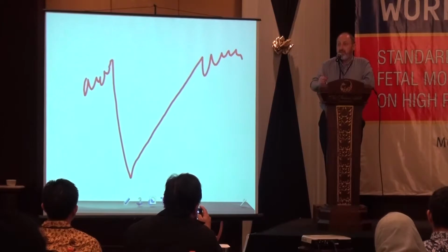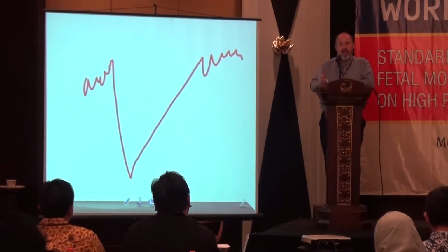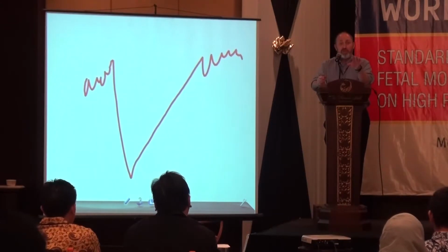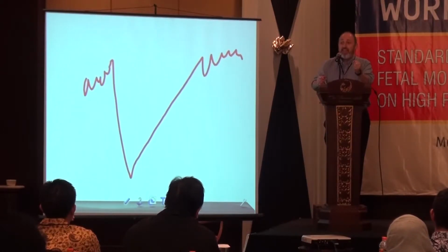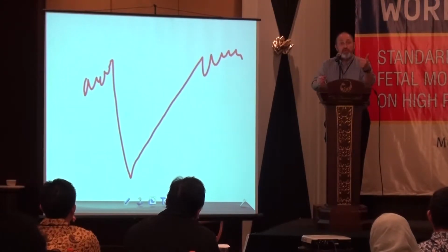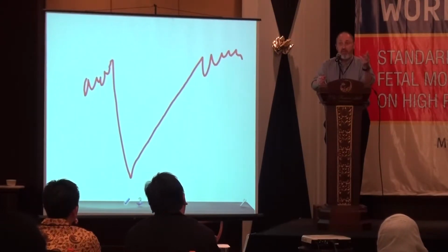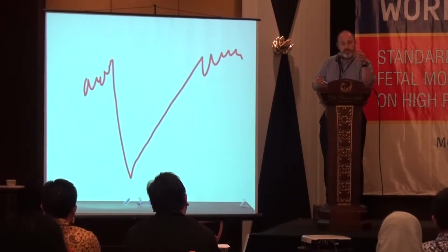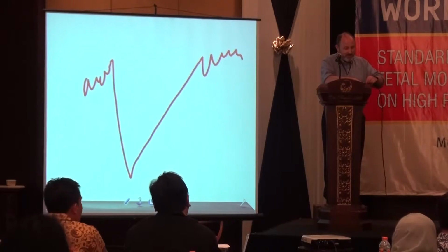Prolonged recovery, atypical. They're the most commonly found atypical decelerations, and there have been reported 40 different types of atypical decelerations. You don't need to know 40 different types of atypical variable decelerations. We just need to know what the typical is. Anything else is atypical. But these ones are the most common ones. Overshoot on recovery of the shouldering, absence of shouldering, biphasic, and rising baseline. And the last one, prolonged recovery. They're the most common ones. Is that okay? Yeah. And I might flip back to the iPad if that's okay, or to the laptop, please.